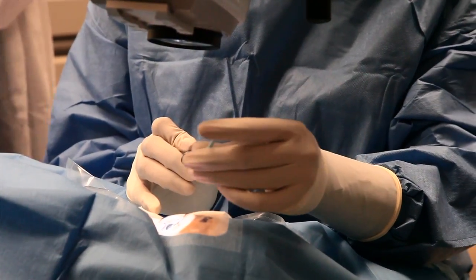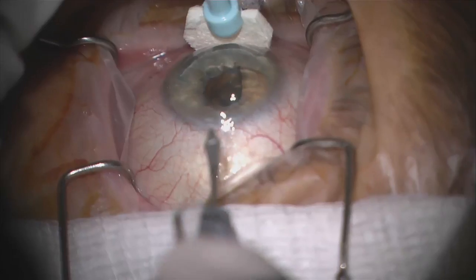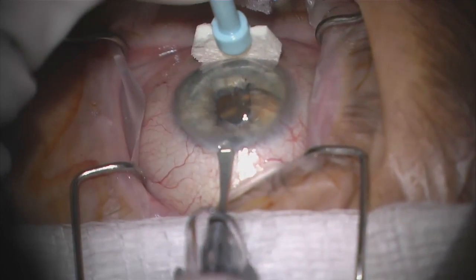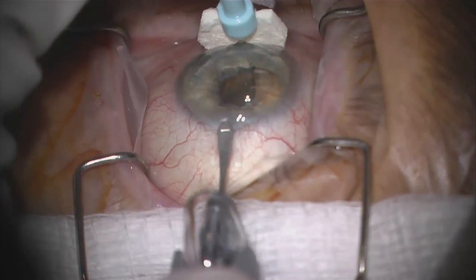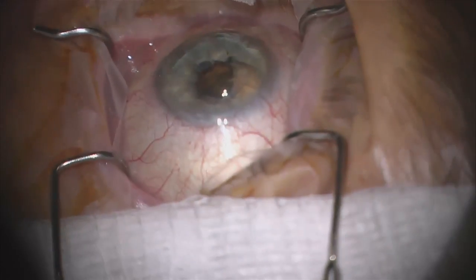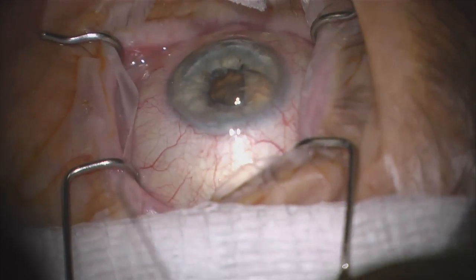After that is attained, then I would take my surgical blade. It has a 1.8 millimeter width. I use a Weck-Cel sponge cut flush, so it's good to use something that will help stabilize the eye as you make a corneal incision in order to make a wound temporally. That corneal incision that I make is typically one that is near the limbus and is a straight and fairly long incision into the anterior chamber.